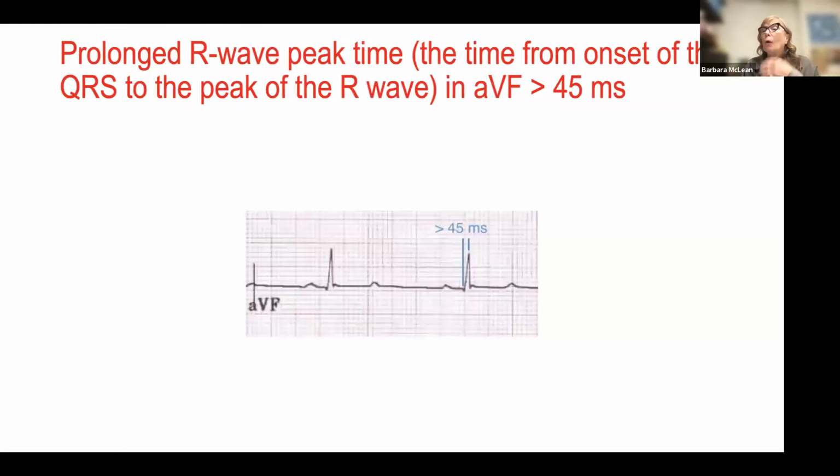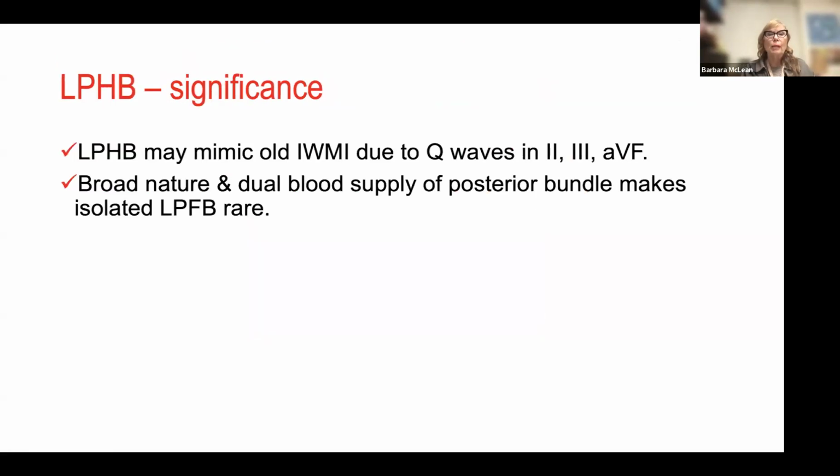That's it. So again, when we're looking at EKGs, we talk a lot about peak time of activation, because you expect activation to be almost straight up and no delay to peak time, which is the peak of the R wave. And you can see here, you've got just a little slope. That's unusual. And that's a delayed activation time, which also is part of fascicular block.